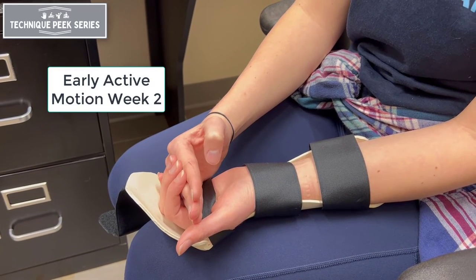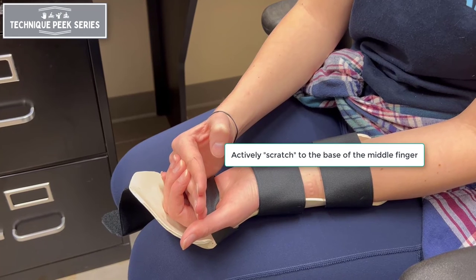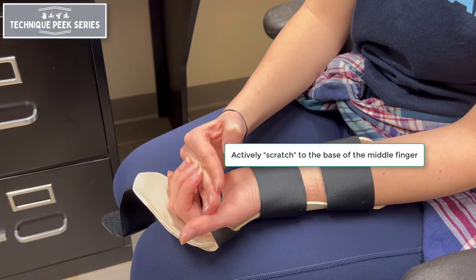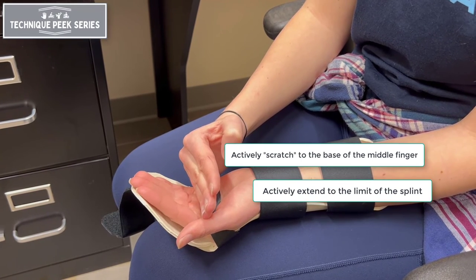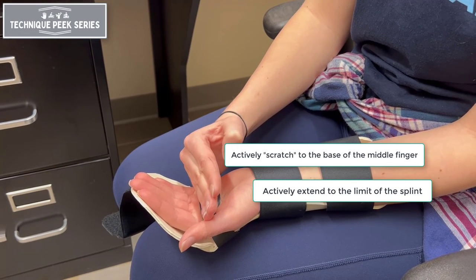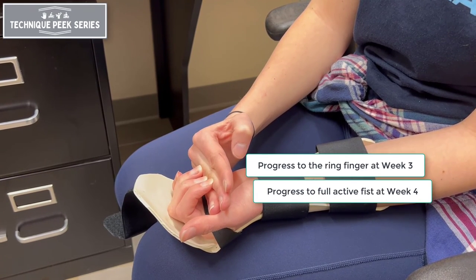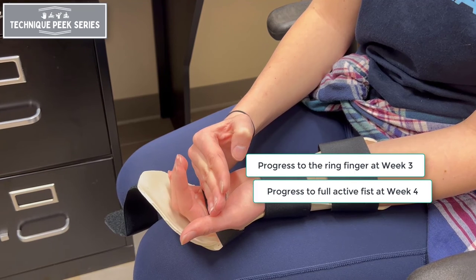During week two, the patient can progress the active scratching motion to the base of the middle finger, always being sure to actively extend to the limit of the splint after each repetition. Progress to the base of the ring finger at week three, and finally to a full active fist at week four.